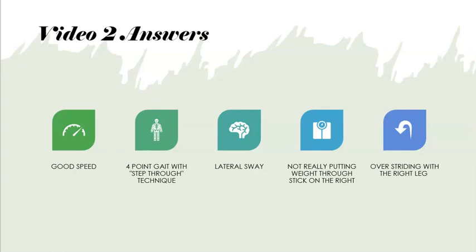This is a lot easier to correct, because in case study 1, she's not really doing anything apart from moving slowly. She's not really doing anything wrong. Whereas here we want to try and correct that lateral sway. So what you could do is, when the patient is walking, stand by the side of them and block excessive lateral sway. That would be a way that I would do that. You could also work with a belt that you're pulling against, reducing the lateral sway.